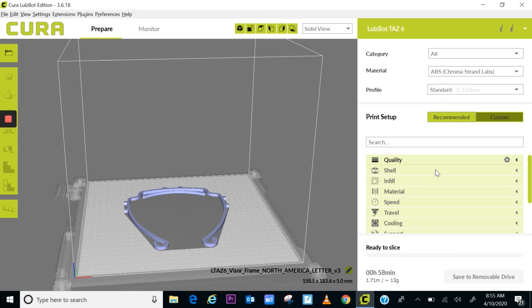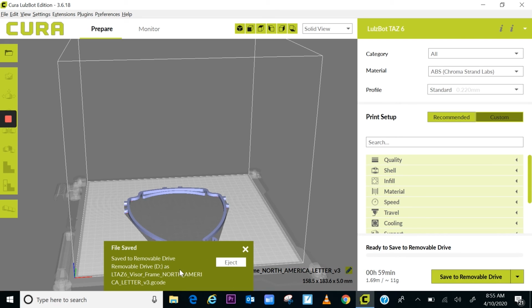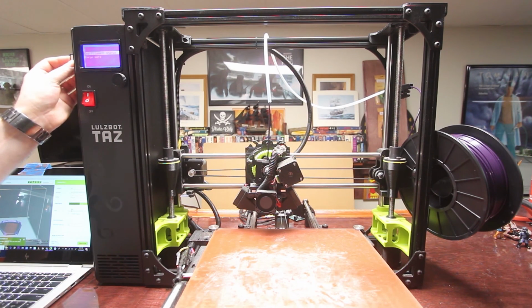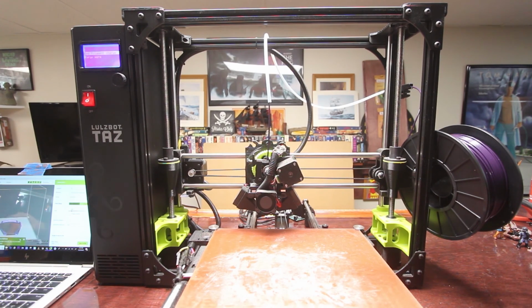Cura does the slicing, says that it's ready to save. It's estimating that it's going to take 1 hour to print. I'm not going to change any other settings. Going to save to the removable drive here. Now we'll eject. We'll plug in our SD card to the side of our machine.